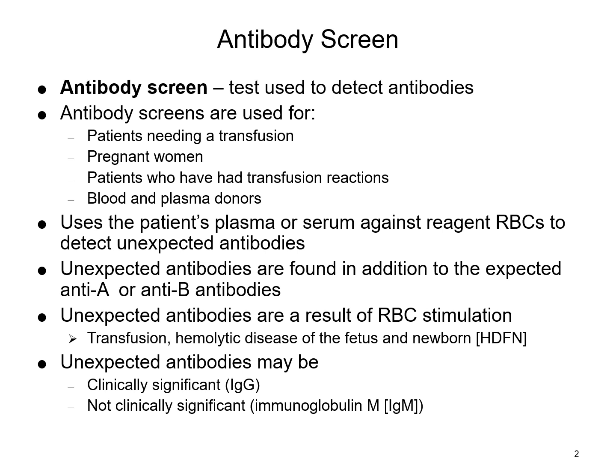And we would also do an antibody screen for patients who have had any sort of transfusion reaction, just to see if any of those antibodies are present that have caused that transfusion reaction to take place. And as well, we also look for the presence of any sort of antibody within our blood donations, so our blood and plasma products.